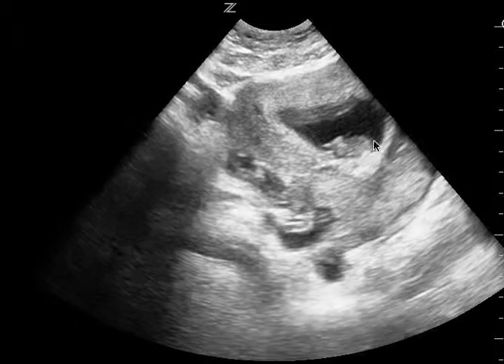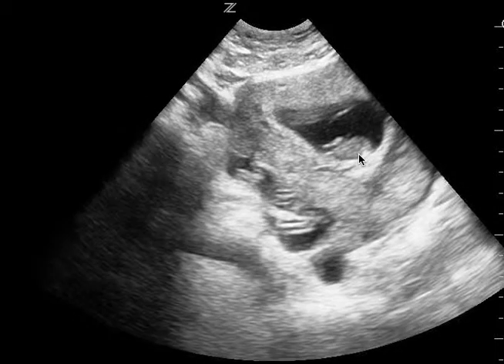This is an OB ultrasound. First thing is a clear IUP and you can see a heartbeat. It's probably a normal heartbeat.